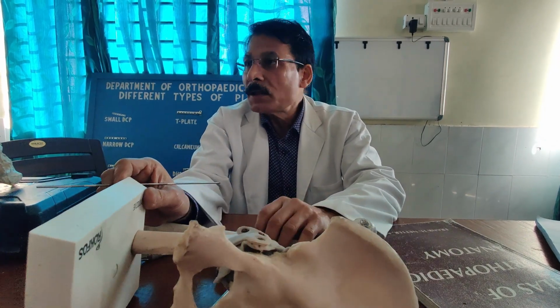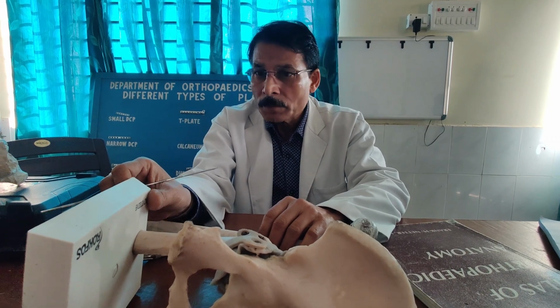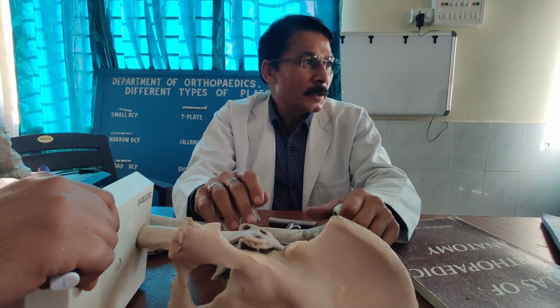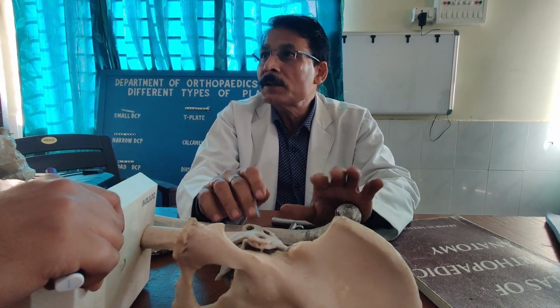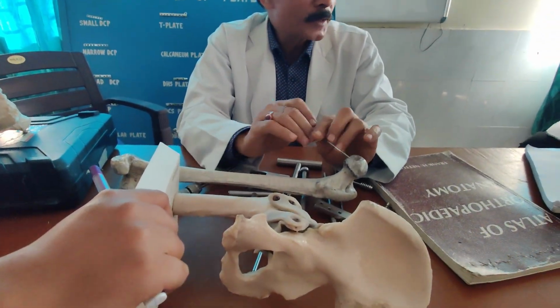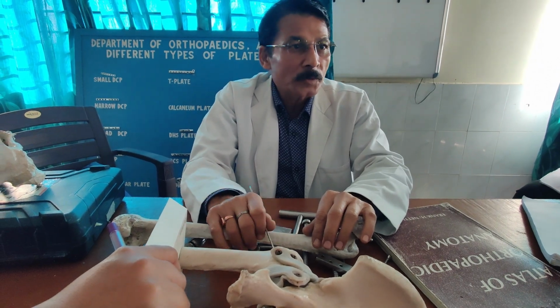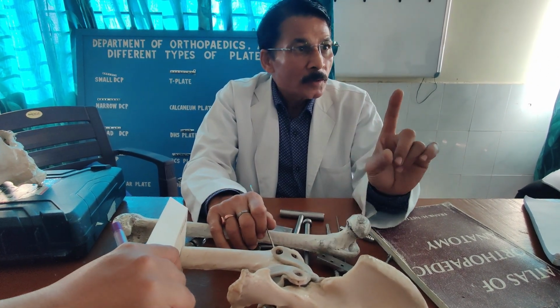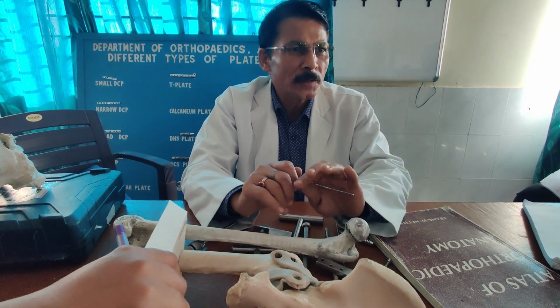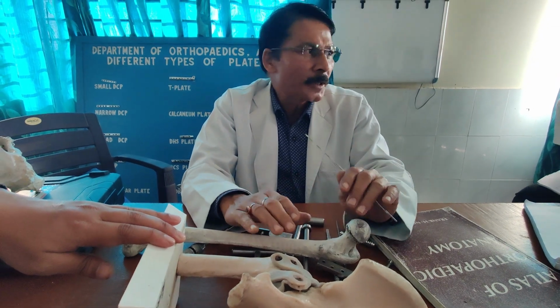The patient is under anesthesia in the supine position. What next? Place the patient on a traction table. Reduction should be confirmed by the C-arm beforehand. In the initial period, people used to pass a K-wire anteriorly or posteriorly, mounting it so as to maintain the reduction. That is an additional thing that can be done, particularly in elderly patients, where the muscles are very relaxed. You reduce it, and again it will come back.